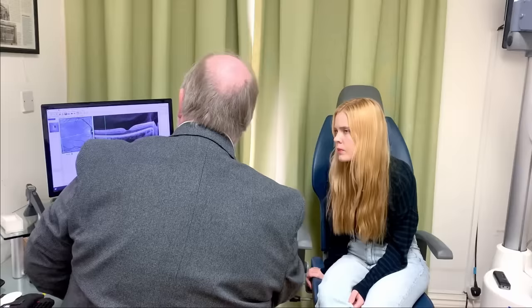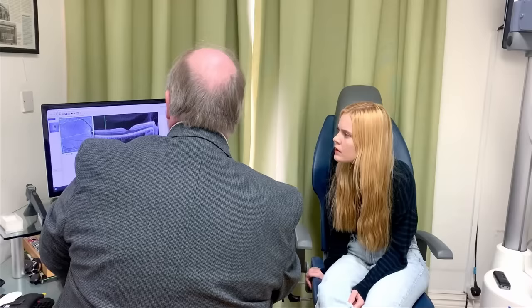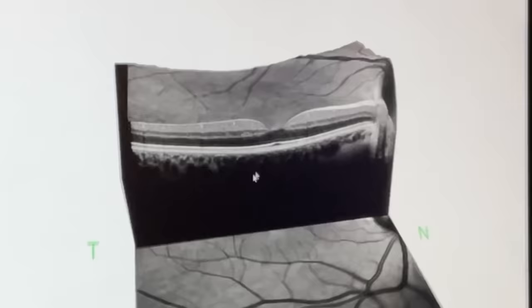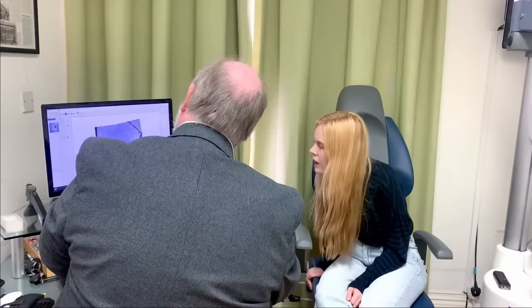So the only place it doesn't do it is this foveal area, and this is our sharpest vision. This area is about as large as a pinhead in real life. It's tiny, and it's what's responsible for all our... So if I spin that round... Oh, it's that little white. So it's that little bit in there, and if I change it now, you can see it becomes 3D. See how it dips down in that dip.